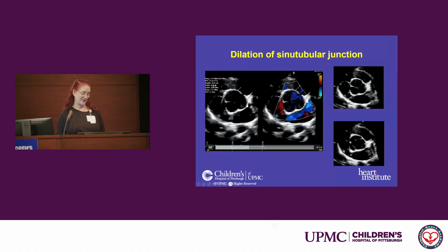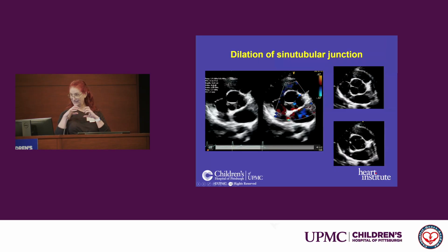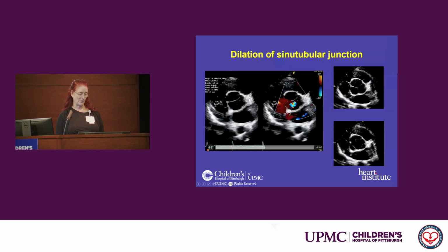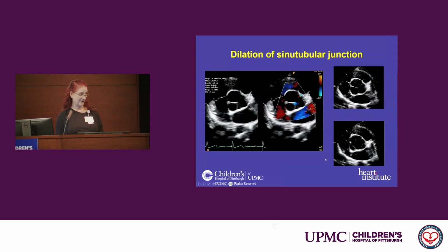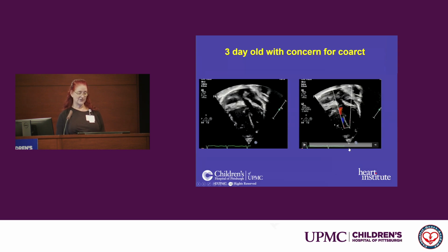I had to look it up. My grandmother used to make them. People sometimes talk about this as the clover leaf sign, the clover leaf rolls, about how the three sections of the roll look as your aortic sinuses become dilated, in honor of Thanksgiving.